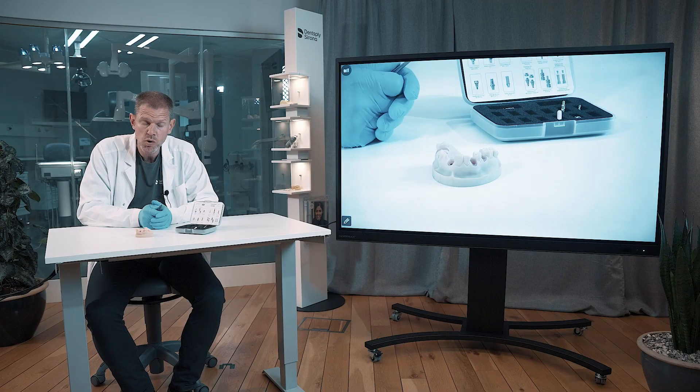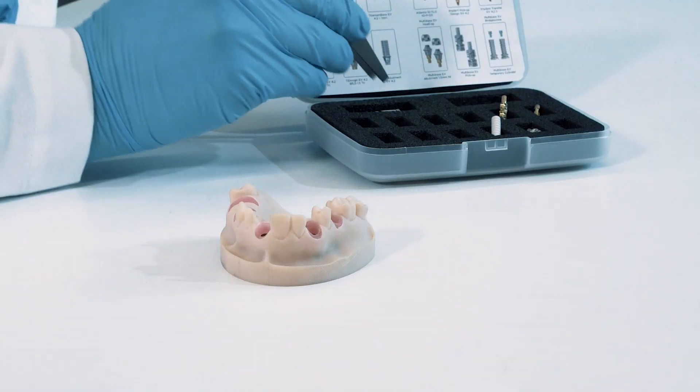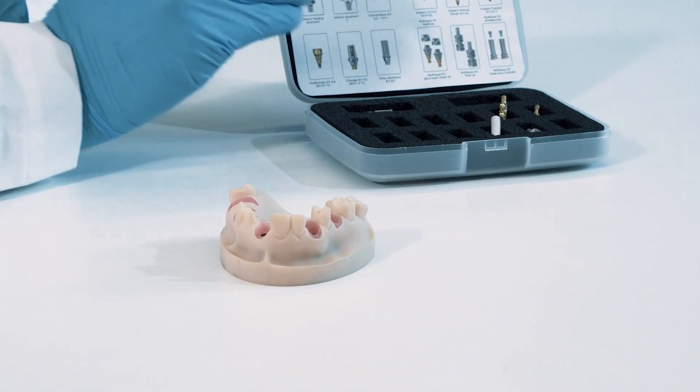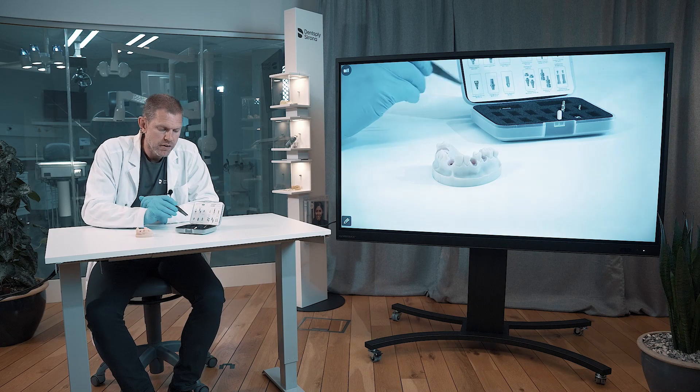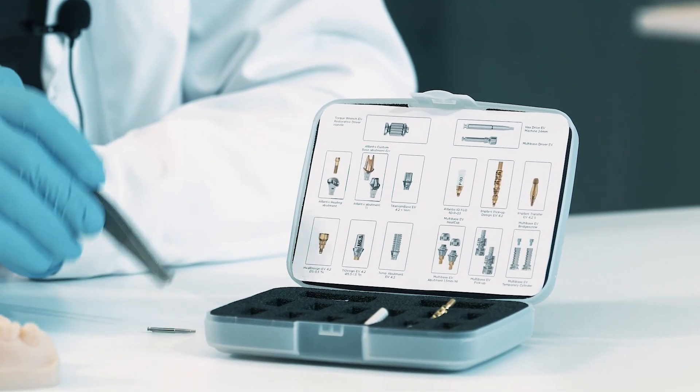To handle the majority of all these products in the box, you need this driver handle that you can see here, as well as the hex driver that we have here. So I put them together first.